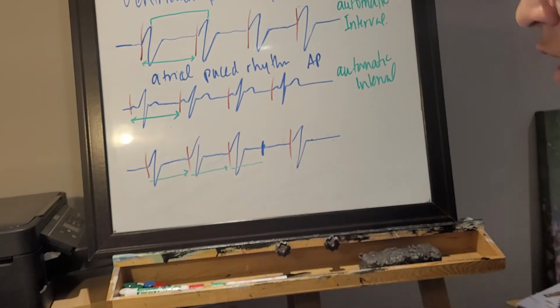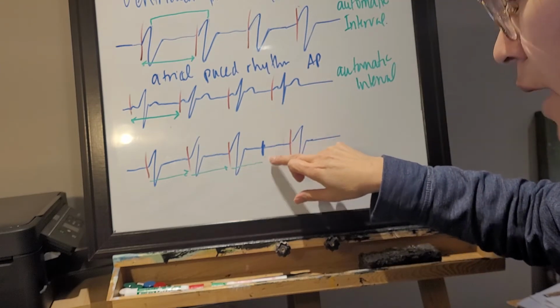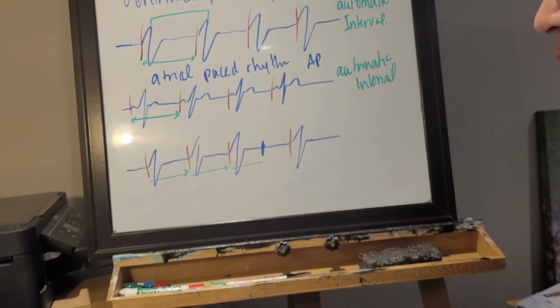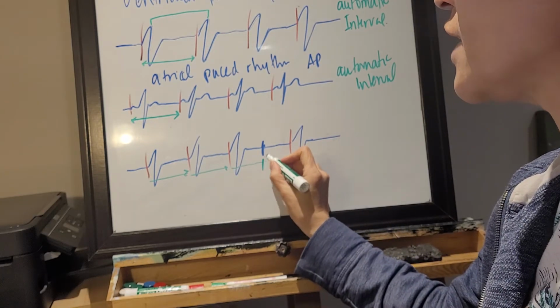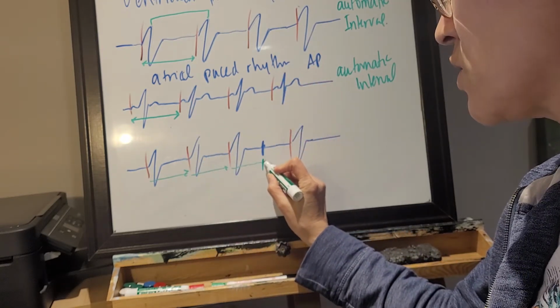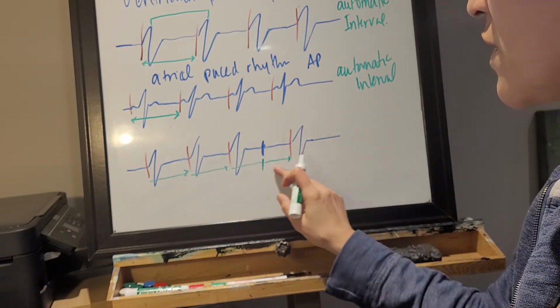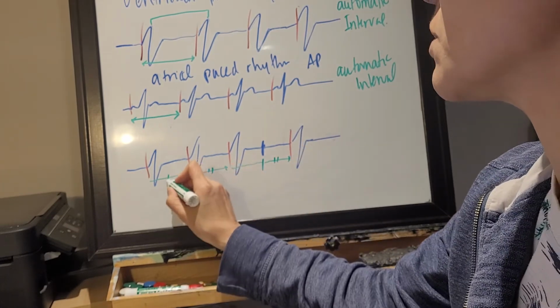And then this should represent an intrinsic ventricular activity. Okay, so that's a normal, imagine, of course it doesn't look like that, but a normal narrow QRS complex. And the pacemaker is set to, again, I didn't have to fire because I sensed intrinsic activity, so I'll inhibit. I'm not going to fire, but I'm going to reset my timer, and I'm going to start looking. And the next time it fires should be at the similar automatic interval. So I'm assuming that this measures the same as this, measures the same as this, okay?